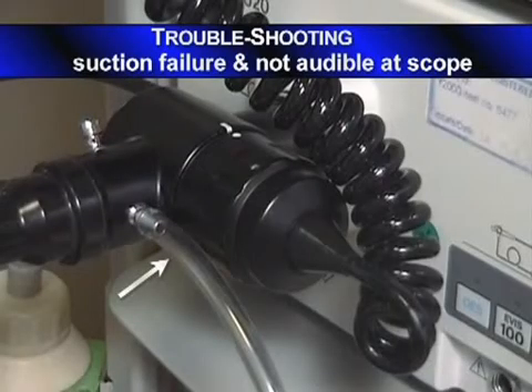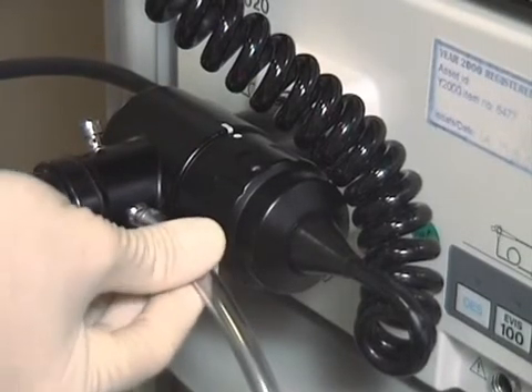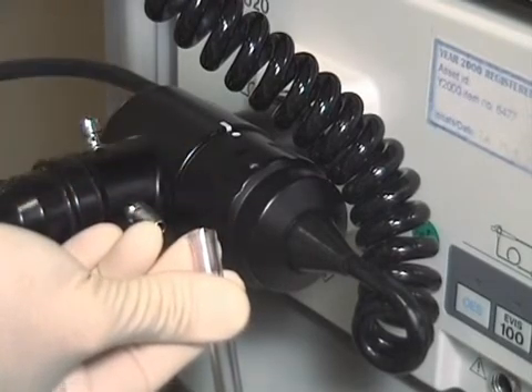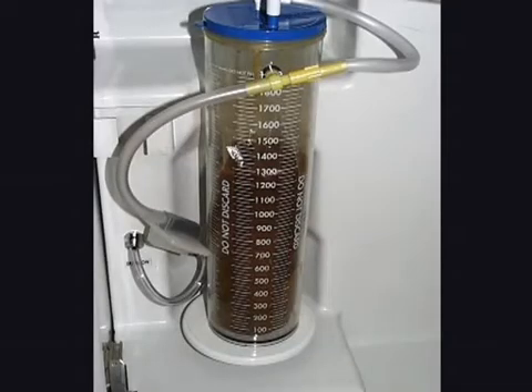If suction fails and isn't audible at the scope, check that the suction has been switched on. Then feel directly on the suction tube — is the vacuum arriving at the scope? If there's no vacuum, is the suction tube kinked, or the suction bag full or faulty?